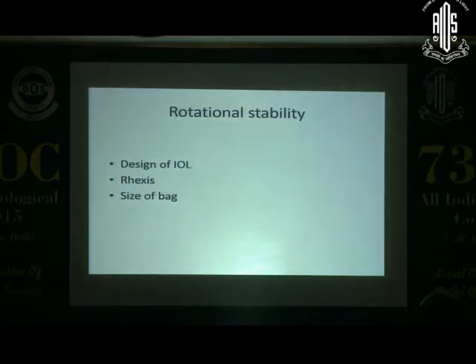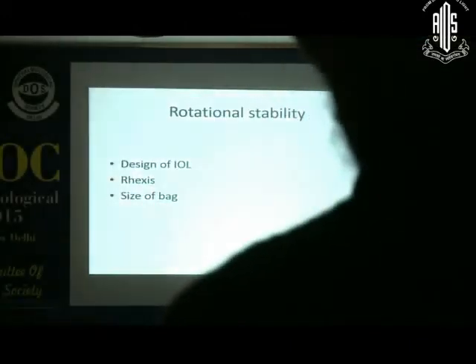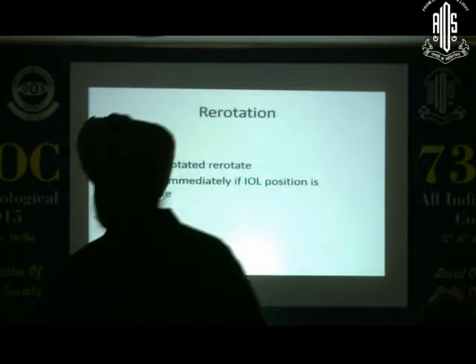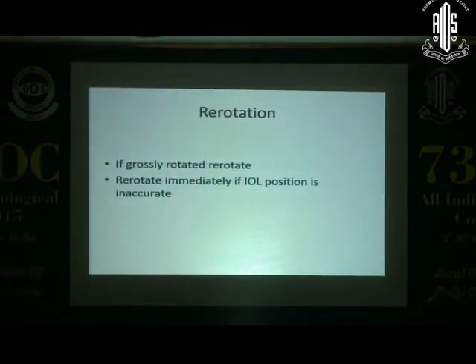What gives the rotation stability? One, the size of the bag. Two, design of the IOL, size of the rexis, and the bag being either inflated or collapsed. If grossly they are not in alignment, re-rotate instantly.